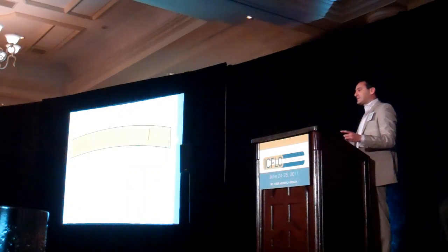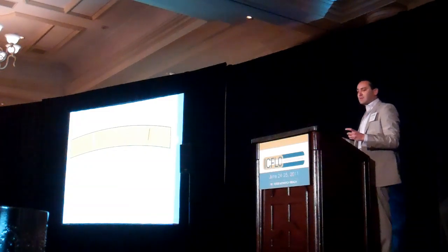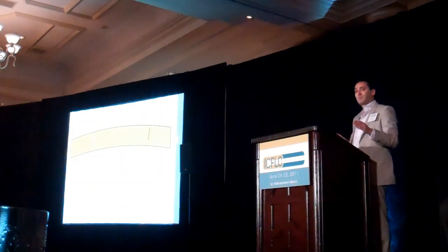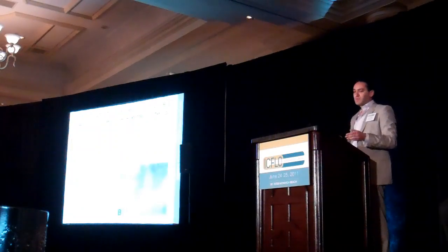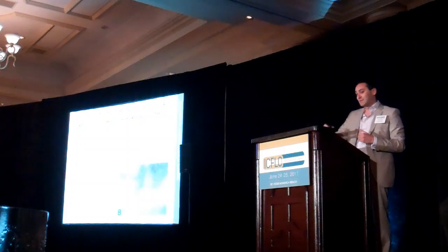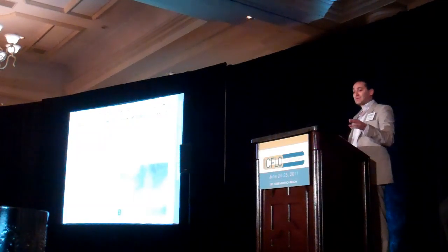But what about decreased risk of infection? There's no longer an epithelial break. Or impact on corneal sensitivity and neuroregeneration. We've seen talks at ASCRS now in terms of breaking the epithelium and the increased risk of dry eye, depending on how large that incision is. But also, we've seen this in literature, that the depth of these incisions and the width of these incisions, or angle, will actually impact regeneration of nerves and sensation of the cornea.